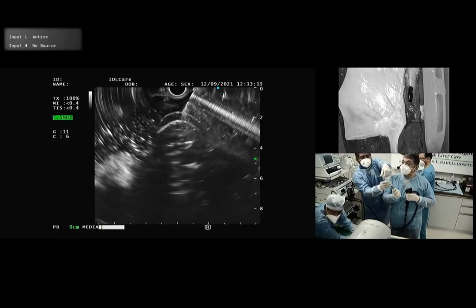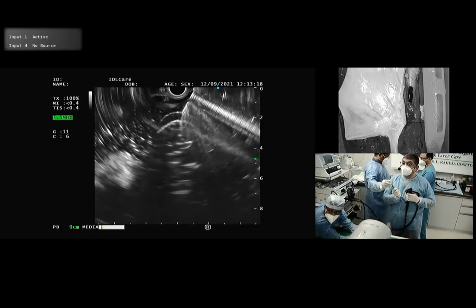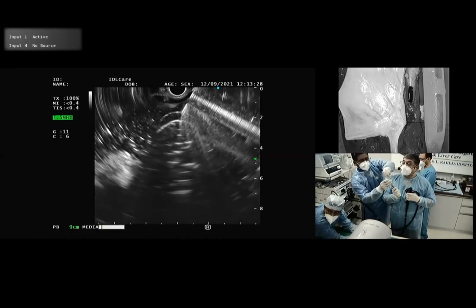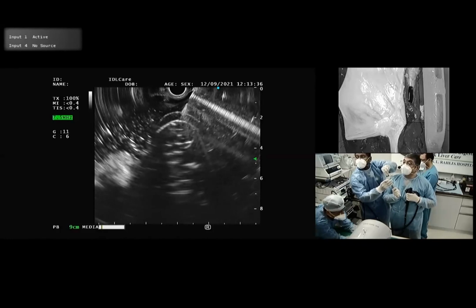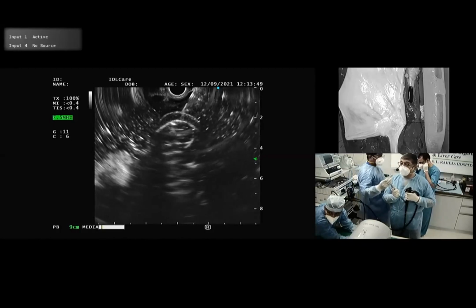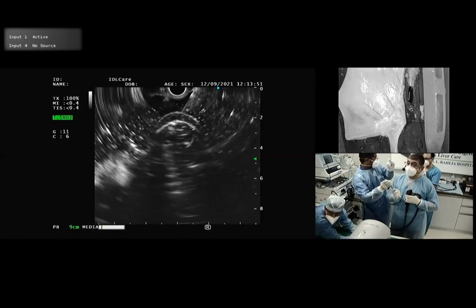Yeah, so he's again injecting some contrast to see that we are in position. Of course, on the EUS, you can see that we are in the right position. So now he has shifted to a Terumo. Let us see whether it helps us. So getting a good position, needle puncture, and then wire passage. These are the things you have to learn. And I suggest that you learn it initially on a model so that you are perfect in rotating the wire, in knowing where it goes.